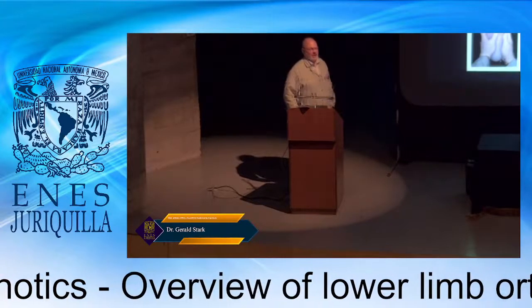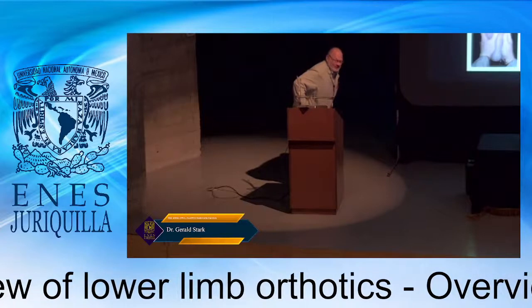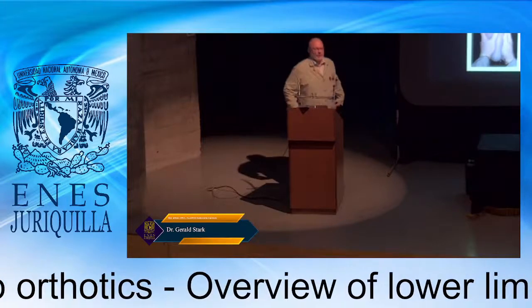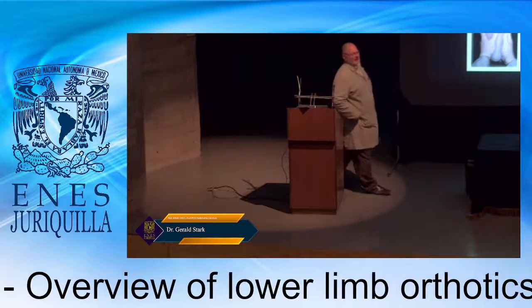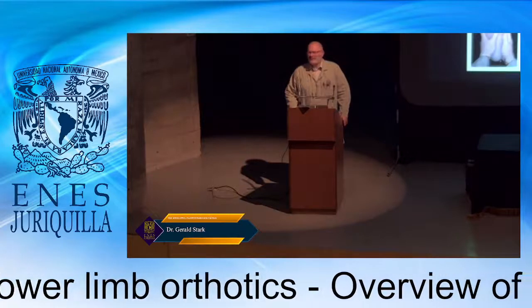The RGOs harnessed hip flexion, which often remained, because if you look at the neurosegmental orientation of the body, your hip extensors are the first to be lost in terms of level of involvement. So if they could harness hip flexion, you could drive the leg back and forth. It worked fairly well, but when a patient got very heavy, it became a little more difficult.